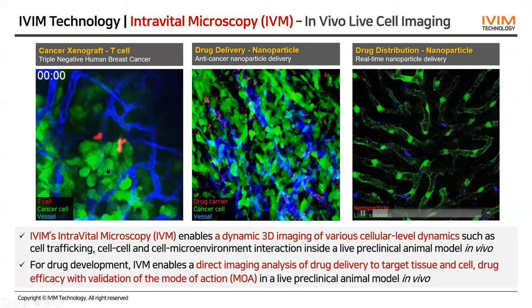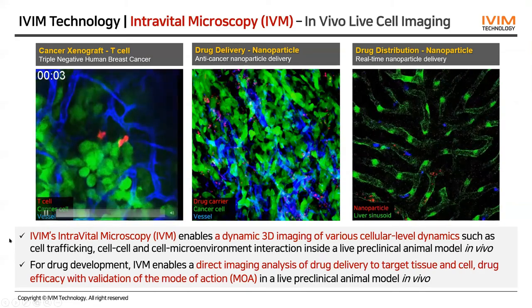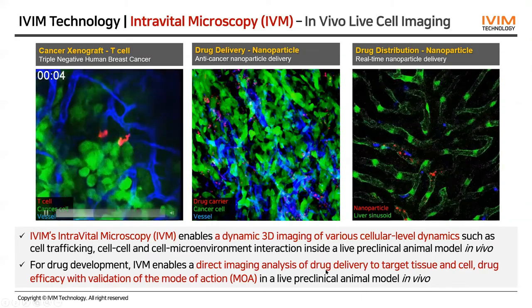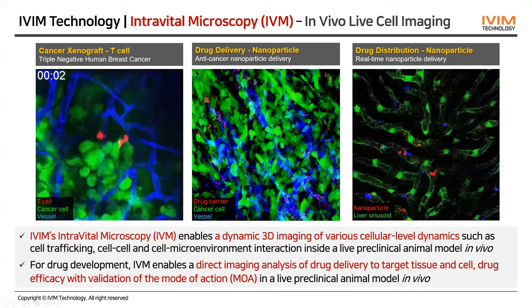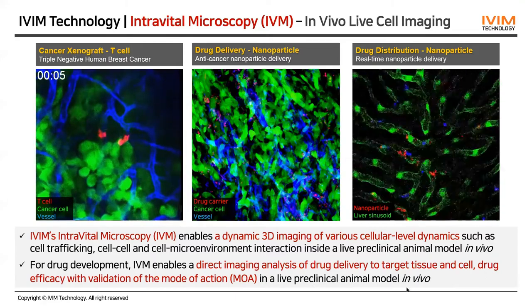On the left-hand side, this is the delivery of the adoptively transferred T cell to this green cancer cell. So drug delivery and also drug efficacy can be directly imaged and analyzed by using intravital microscopy in a live preclinical animal model.